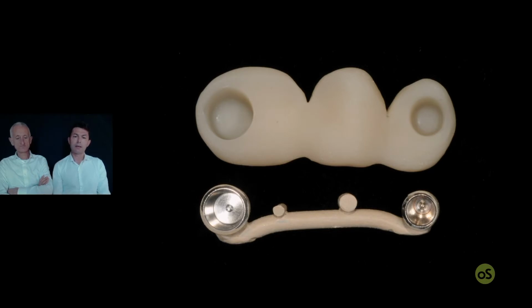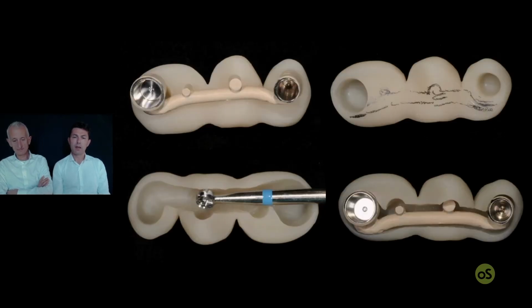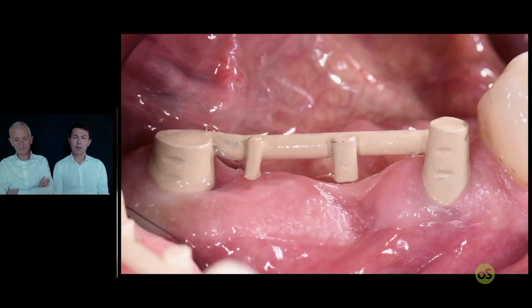Now it's time to open the slot to place the framework inside the new restoration. Before, I mark the shape of the wire and open with the round bar, and I open completely the space for the framework. And now it's time to match the two parts in the mouth.